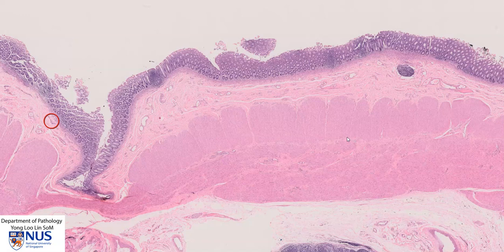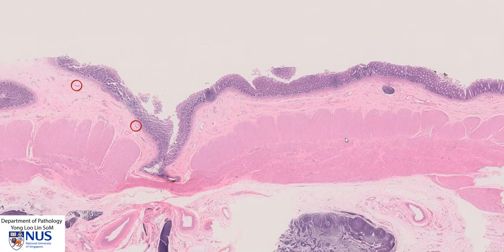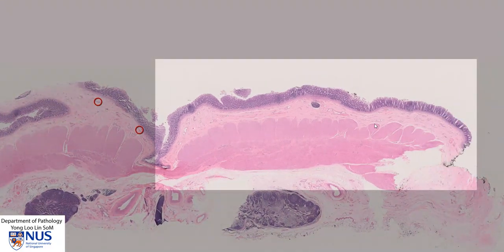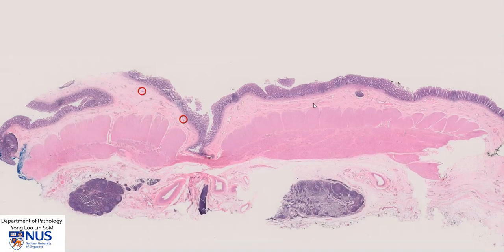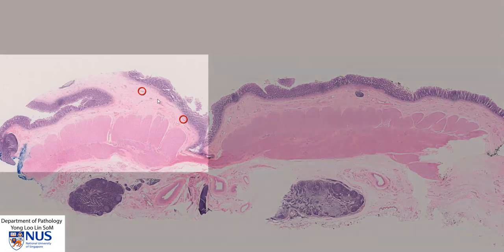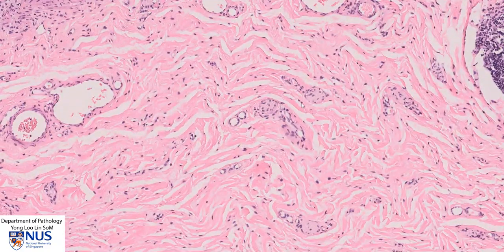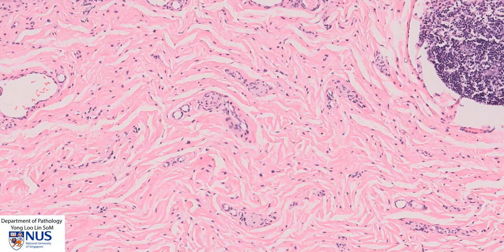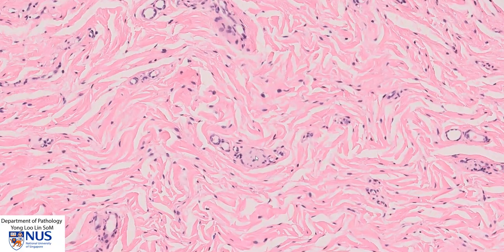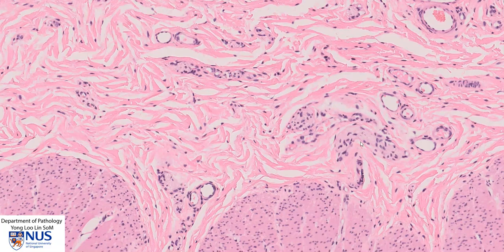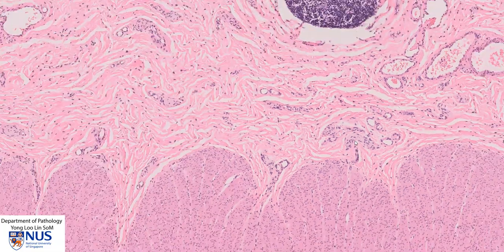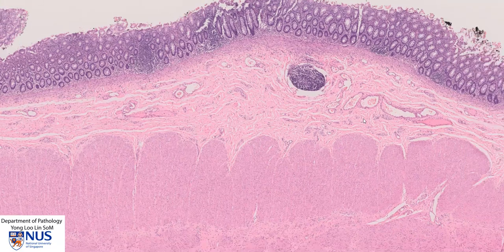Hirschsprung disease is also known as congenital aganglionic megacolon, meaning there is a distal segment of the rectum that is devoid of ganglion cells. Here is the abnormal segment — this is usually very small in diameter and shrunken because of functional obstruction, and the proximal, normally innervated segment is usually dilated due to the obstruction. Looking at the submucosal nerve plexus, we can see some small nerve twigs, recognizable by their pale color and the presence of spindle cells — these are Schwann cells — and we do not see any ganglion cells.